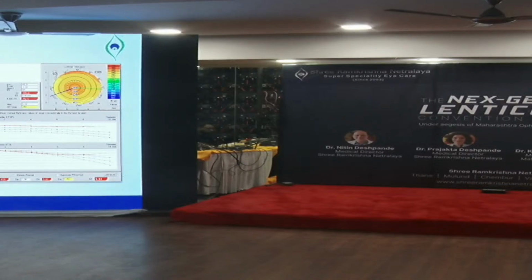Accordingly, they have graded it as if it is less than 5 microns, it is normal, between 5 to 7 microns suspicious, and more than 7 microns it is abnormal. And similarly, parameters have been given for the posterior elevation as well.